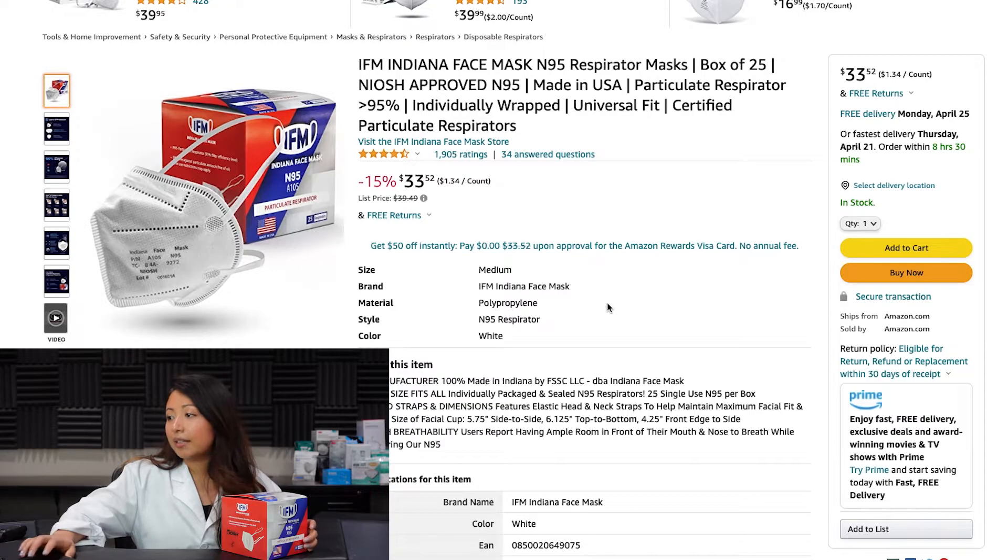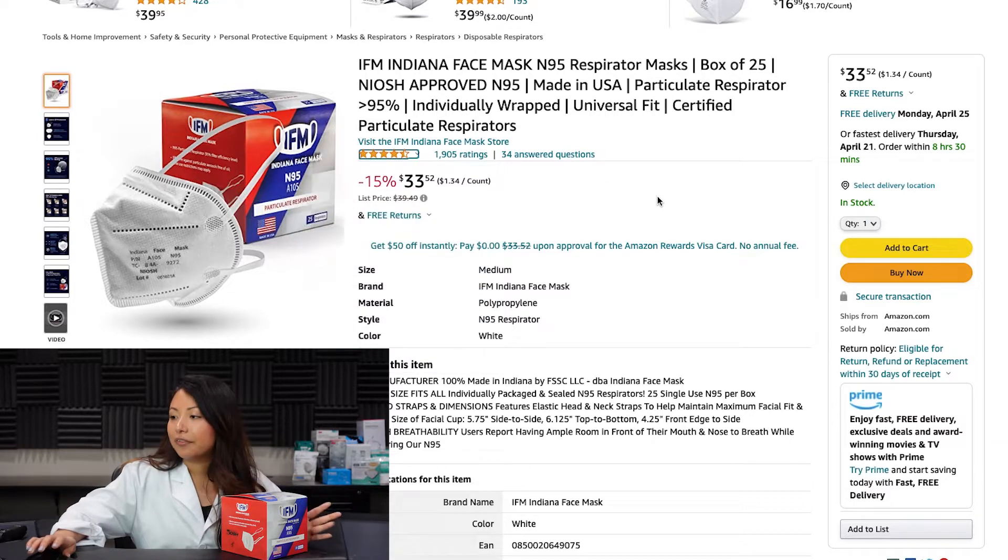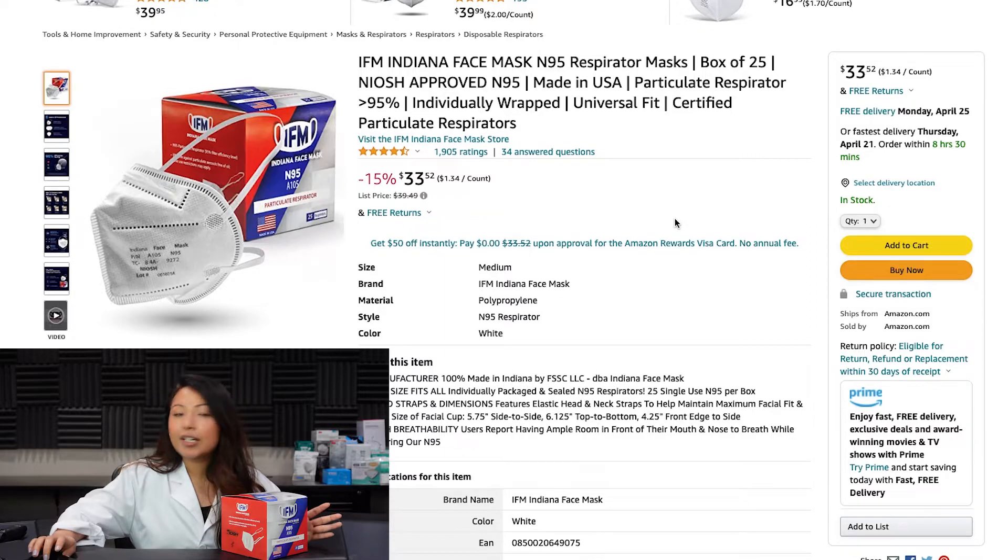This is the IFM Indiana face mask N95 respirator. This is a box of 25. They are a five-layer face mask. They're currently sitting at a 4.4 out of 5 rating with almost 2,000 reviews. The seller is Amazon.